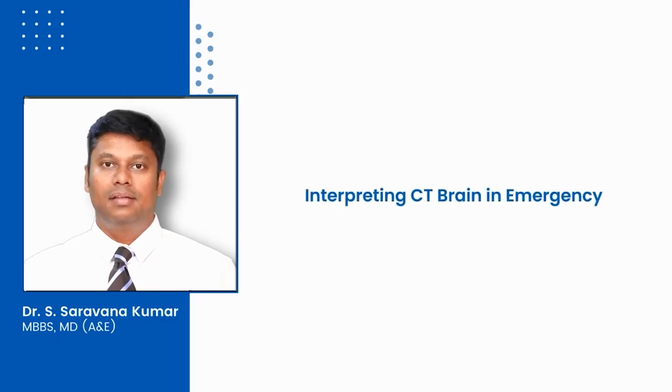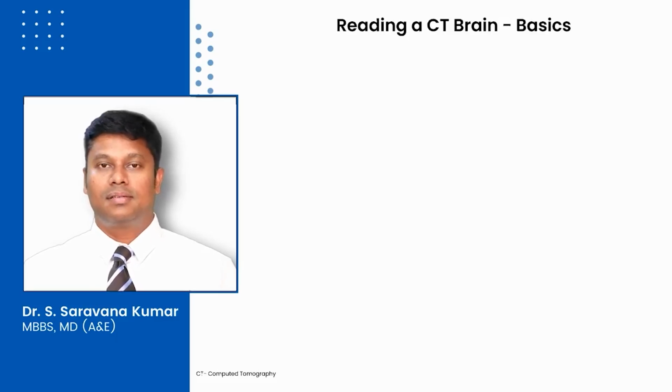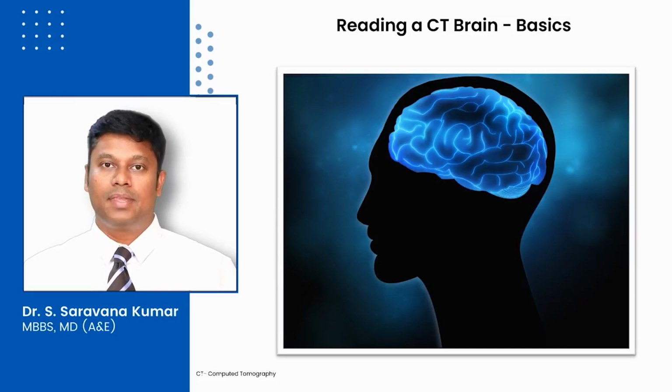In the next 30 to 40 minutes, we will go through how to read a CT scan, especially a CT brain, in an emergency department. We emergency physicians have to do repeated or regular CT scans for many diseases. The most commonly done CT is the CT brain, and clearly we need to have some basic understanding of how to read a CT scan.